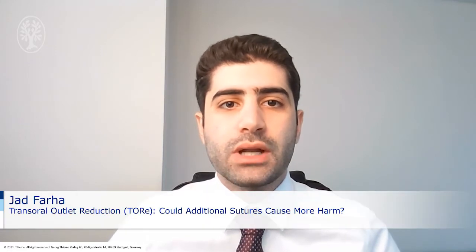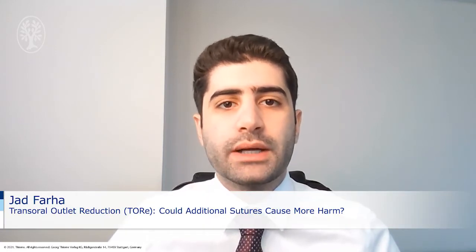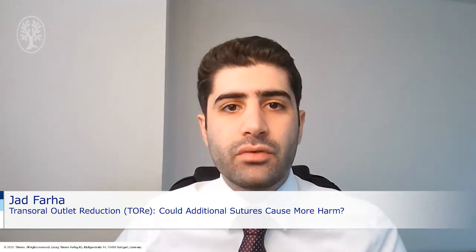Transoral outlet reduction is one of the leading minimally invasive endoscopic procedures to reduce the gastrojejunal anastomosis post-Roux-en-Y gastric bypass. Now, there are several proposed suture patterns, such as the single purse string suture pattern, the interrupted pattern, and the double purse string suture pattern. We adopted the double purse string suture pattern, which utilizes two running sutures placed sequentially along the gastrojejunal anastomosis.